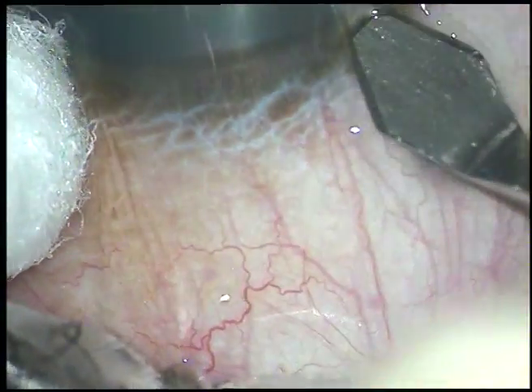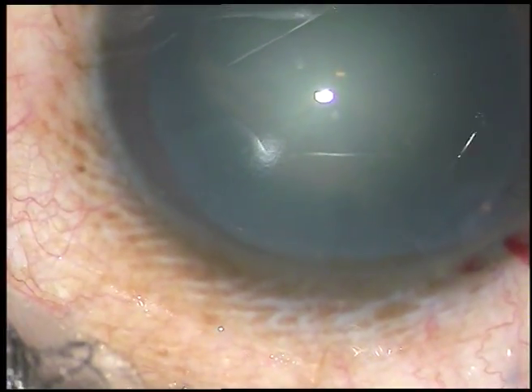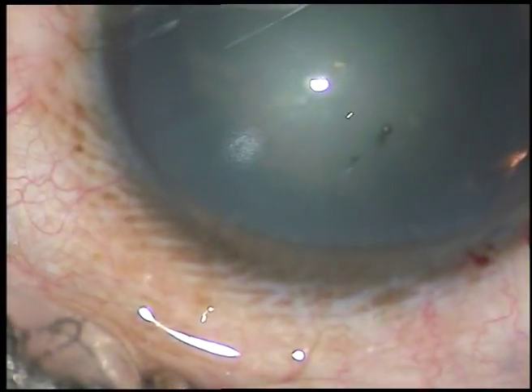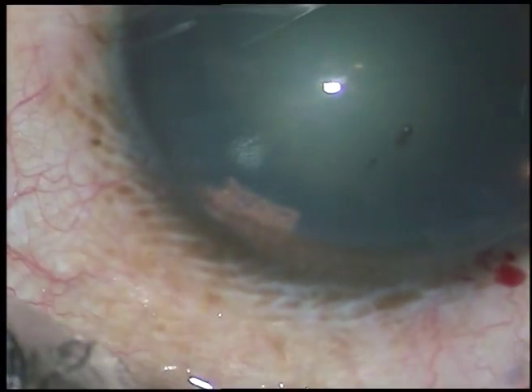Dear colleagues, this is a routine unedited phacosurgery. The main incision has been placed and now viscoelastic substance has been injected into the anterior chamber. This is a side port on the left side of the main incision.